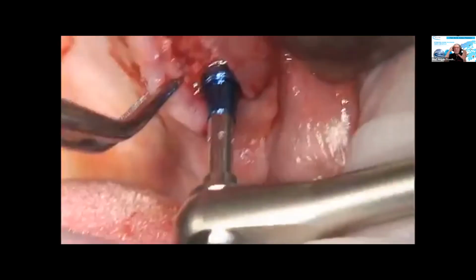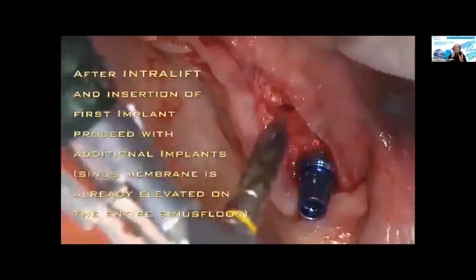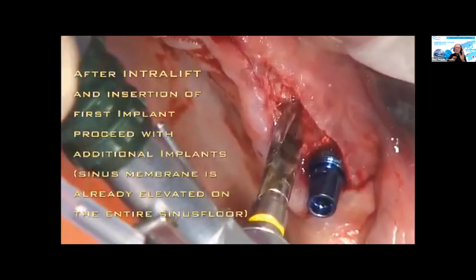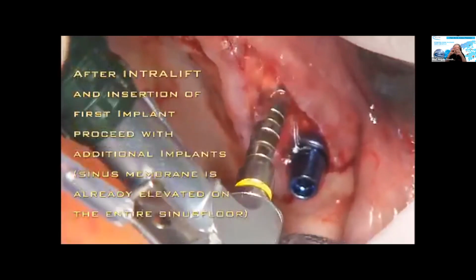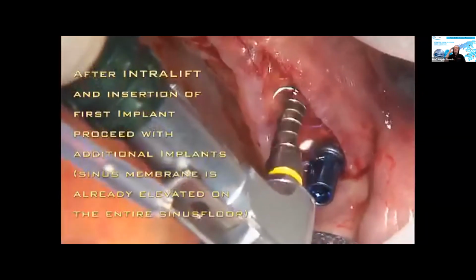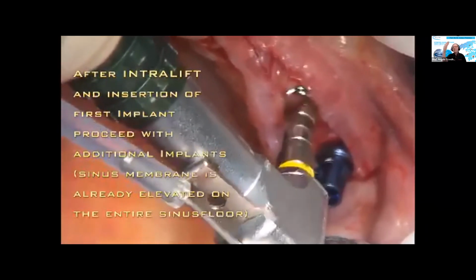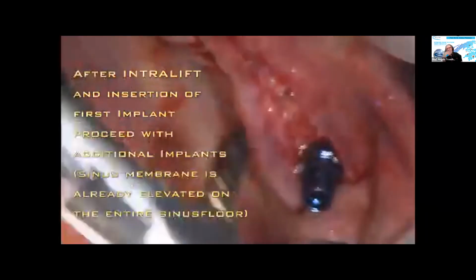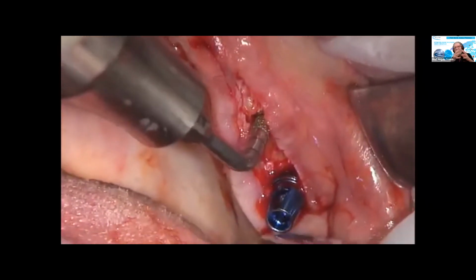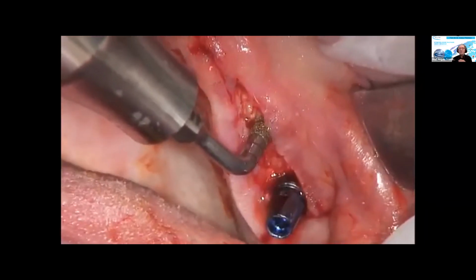Why? Because always keep in mind, also the implant consumes volume. So if you now place in 2 milliliters of bone graft material and then insert the implant, you enlarge the volume, and suddenly the patient will tell you, oh, doctor, I think something ripped inside my sinus, because you didn't subtract the volume from the volume you applied to the sinus, to the subantral scaffold. So always keep in mind, implants consume volume, so you have to subtract the volume from the amount of bone graft you apply.